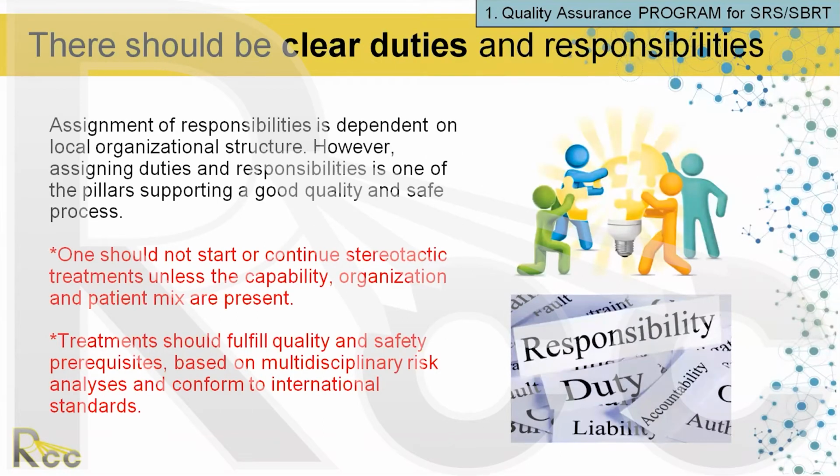So first and foremost, like I said, it's a team effort, but there should be clear duties and responsibilities. The nurse has her role or his role. The therapist, the technologist has their role, the physicist, the physician. So what those roles are should be very clear. Who's responsible for checking what item? Those things should be known. And you shouldn't really start this process until it's clear who your team is and what their roles and duties are going to be. It's essential, because you don't want someone to say, oh, well, I didn't check that, I didn't know it was my responsibility. You always want everyone to know what their responsibility is.